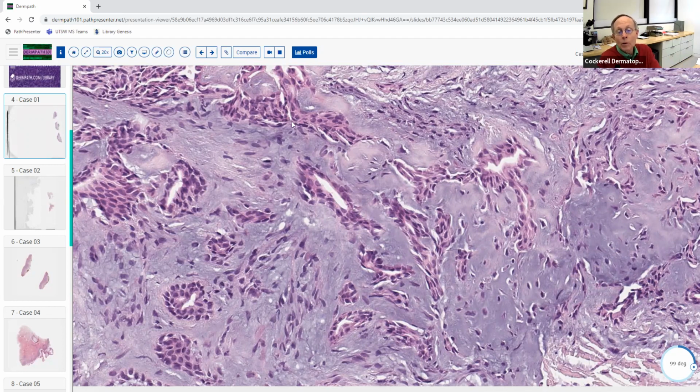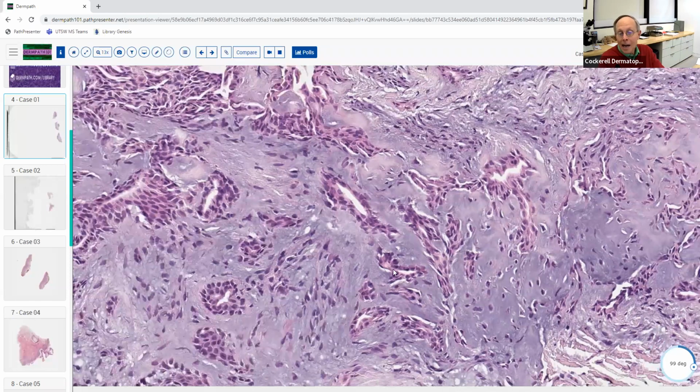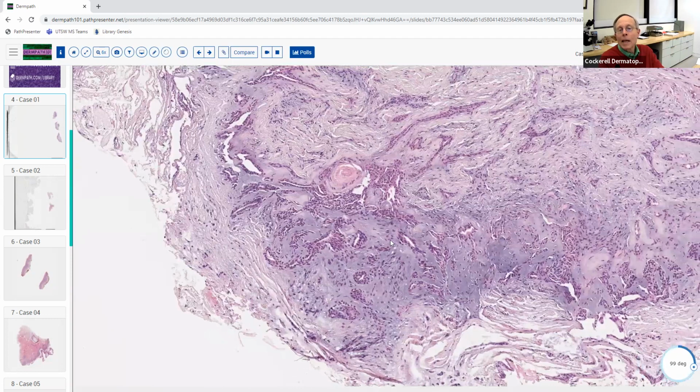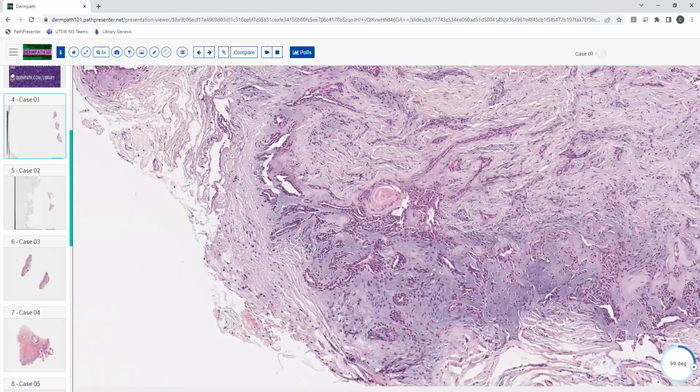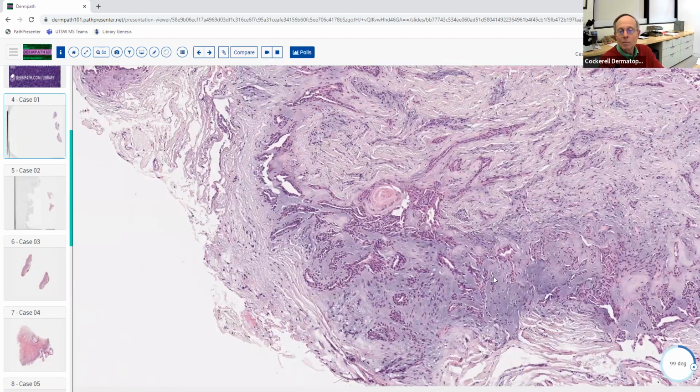Normally what you have is just a lot of mucin. Anytime you get tons of this hyaluronic acid, which is what you're seeing over here, even in a cutaneous myxoma, sometimes those can develop some cartilaginous metaplasia. So this entity very commonly gives you that. So you know the answer already, right? What is this diagnosis? Yeah, the cartilage is making me think of a mixed tumor. Yeah, that's exactly what this is, a mixed tumor. And what's the other name for mixed tumor?